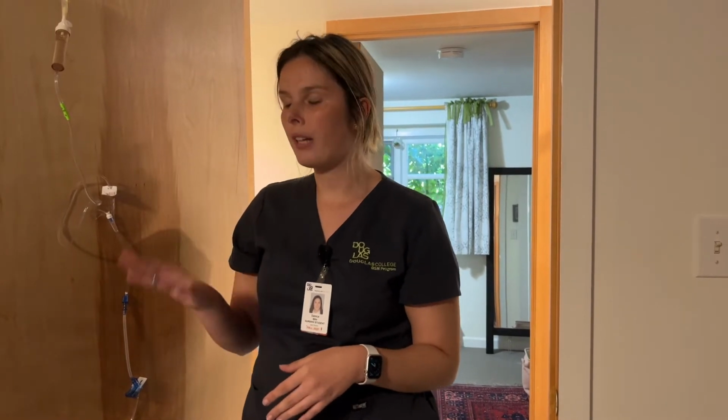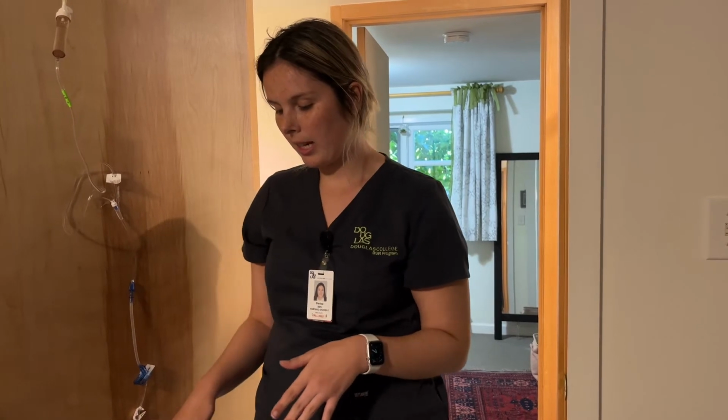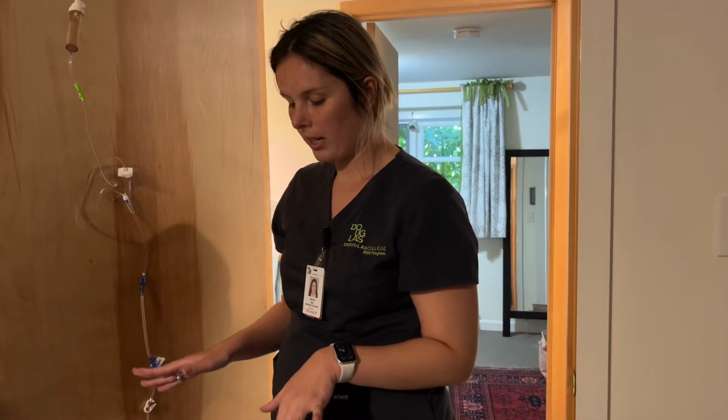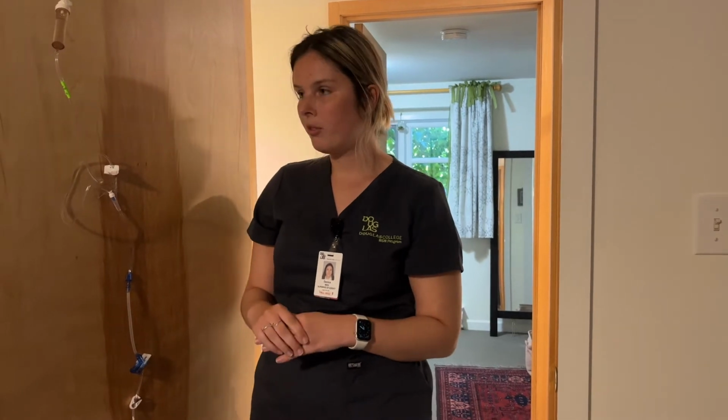As well, if this was a saline flush, I would have to flush before and after. And when it's not compatible, I flush with 10 mils before and after. And with a saline flush, it's usually 3 to 5 before, and however many mils the medication was after. Okay, moving on.